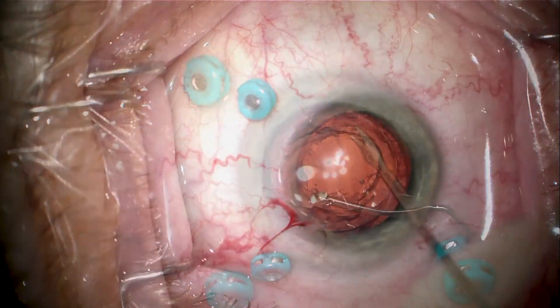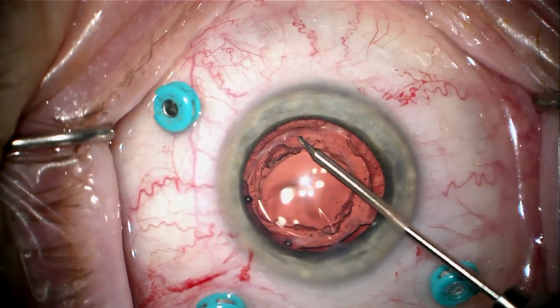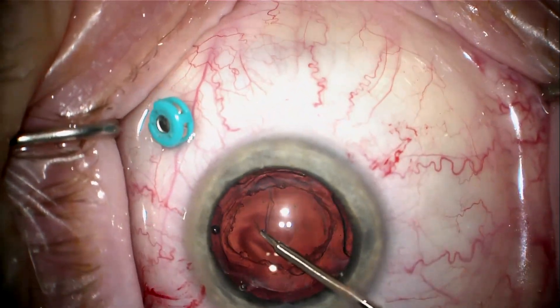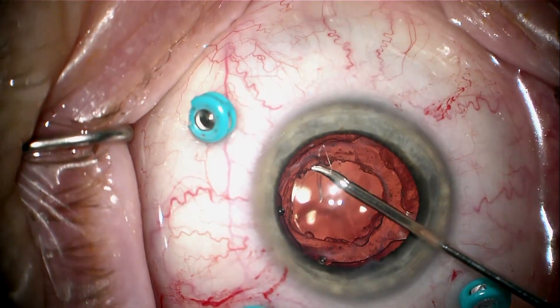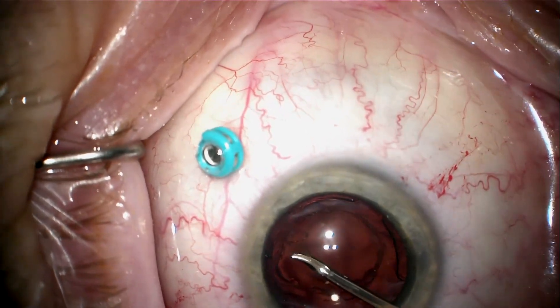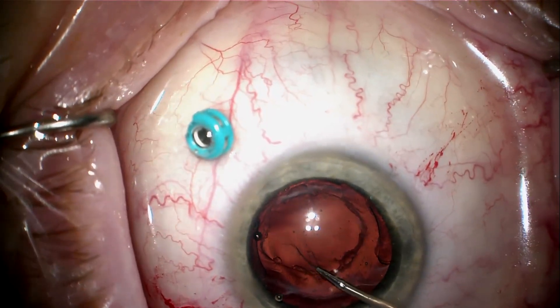I've placed my pars plana trocars, and I'm going to go ahead and expand the rhexis by making a little nip in the anterior capsule and tearing it. When I get to about here, the tear stops because there's some fibrosis, and I don't want to just keep tearing because it'll go peripherally, so I make another little cut through that area of fibrosis and then complete this secondary tear to expand the rhexis a bit.